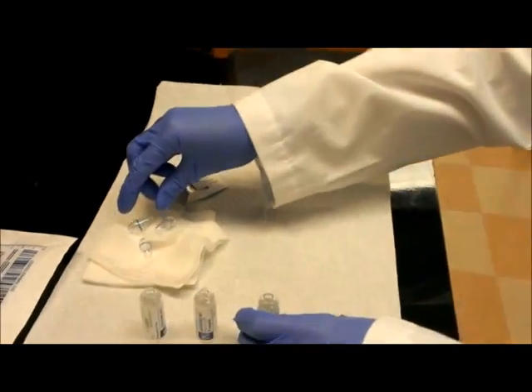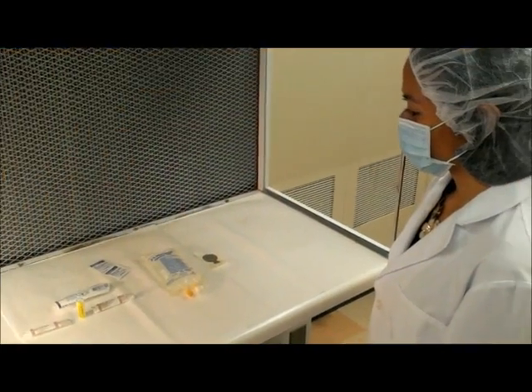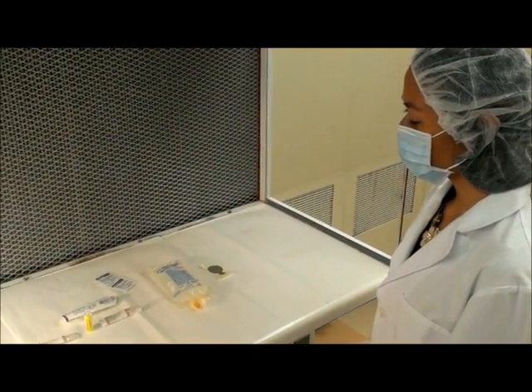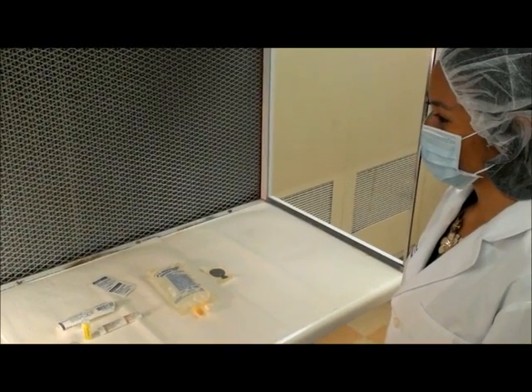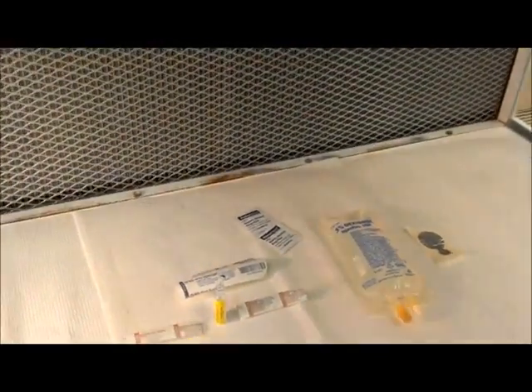Now that we have shown you some techniques, we will show you how to do the whole process in the hood. Christine has already properly gowned. Make sure to thoroughly wash your hands and follow the correct order of gowning so as to reduce contamination. Now Christine will collect the materials.